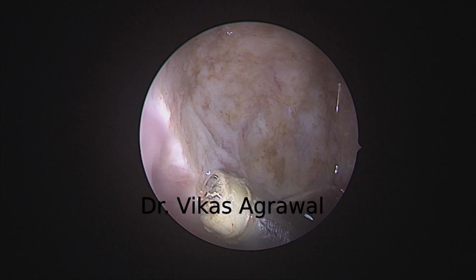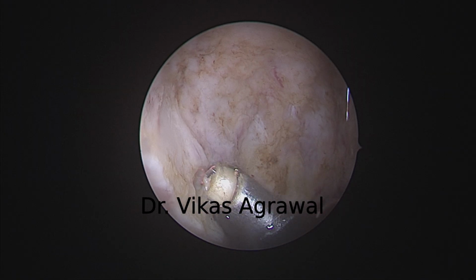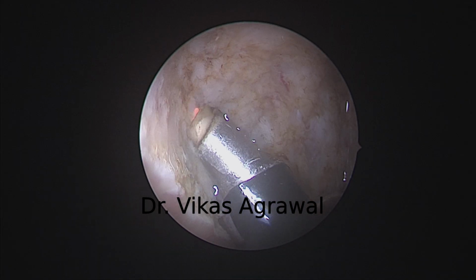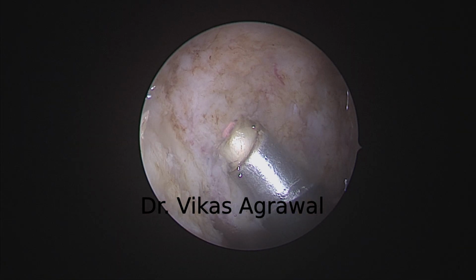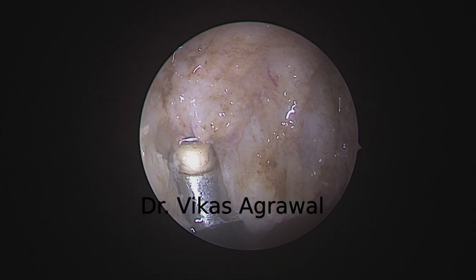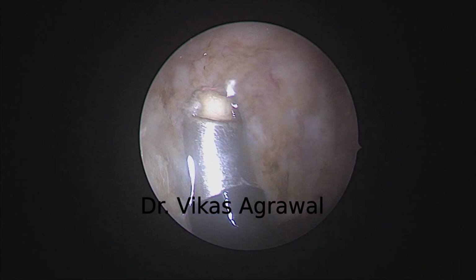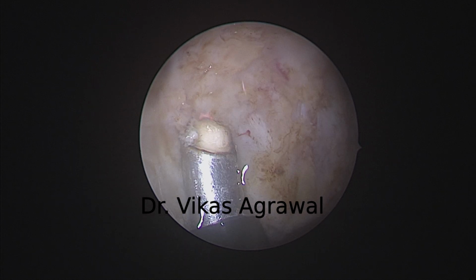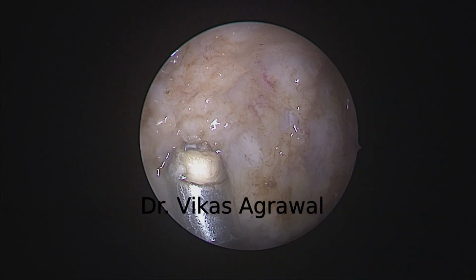Anteriorly, as I said, was torus tubarius, and when following it back, I'll reach into the fossa of Rosenmuller. That's the fossa of Rosenmuller. Lot of lymphoid tissues here, which I need to ablate. As I said, the wand is getting exhausted. That's the fascia. That's the fascia.